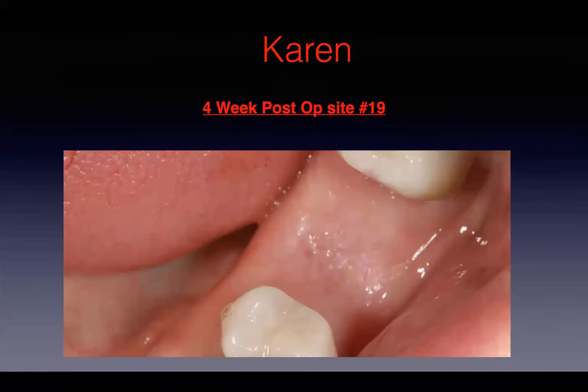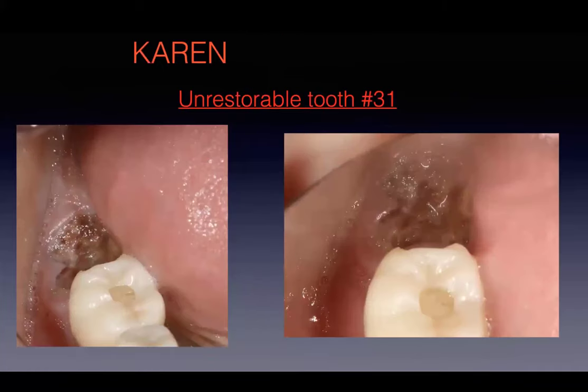Tissue healed very well there. So at her 4-week post-op, now she was complaining of extreme pain from tooth number 31. She was planning on having that removed back home because she's here part-time. So we set up to extract 31.